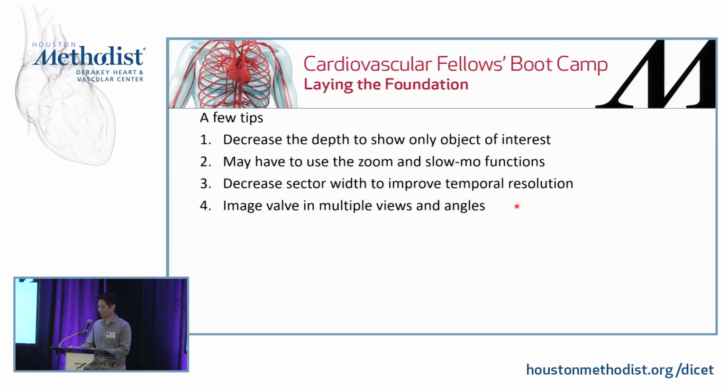So a few tips on imaging these valves. This is another important slide. So there's only 2 important slides. If you paid attention for about 1 minute, 30 seconds for the first slide, 30 seconds for this second slide, then that's pretty much my entire talk.